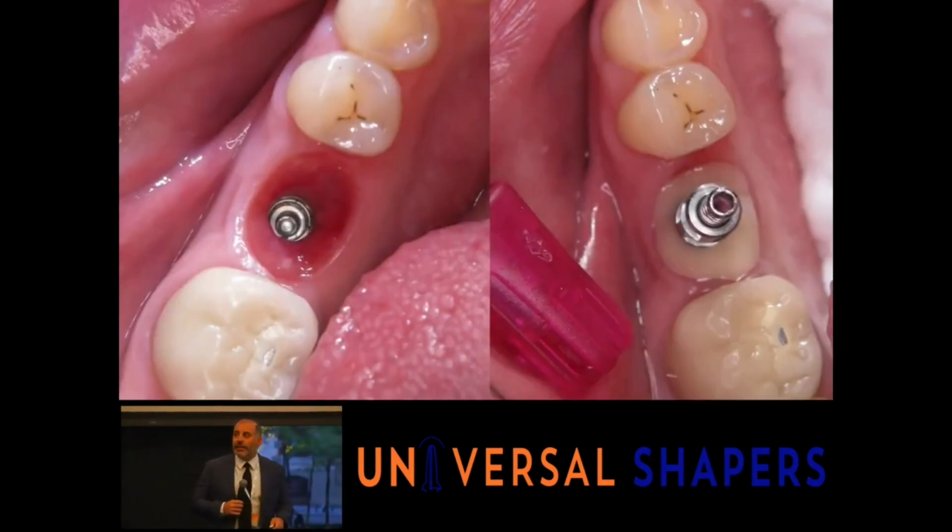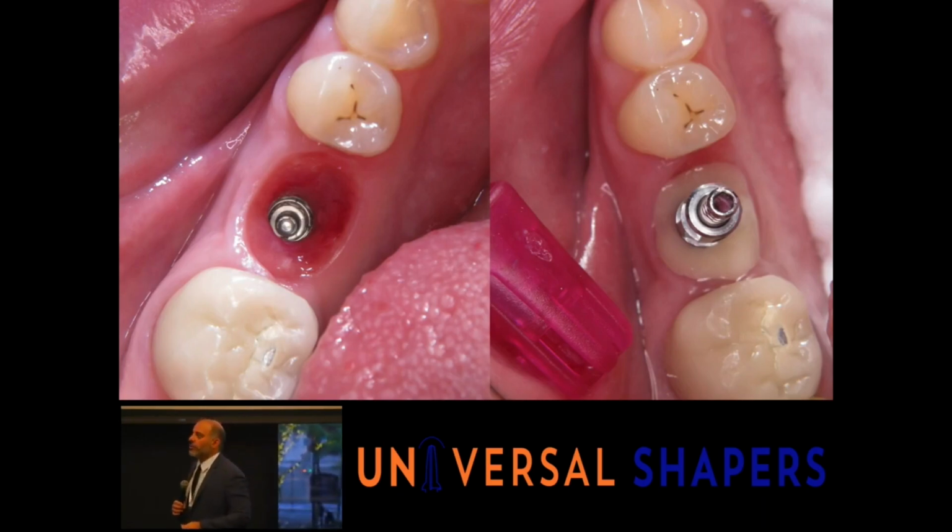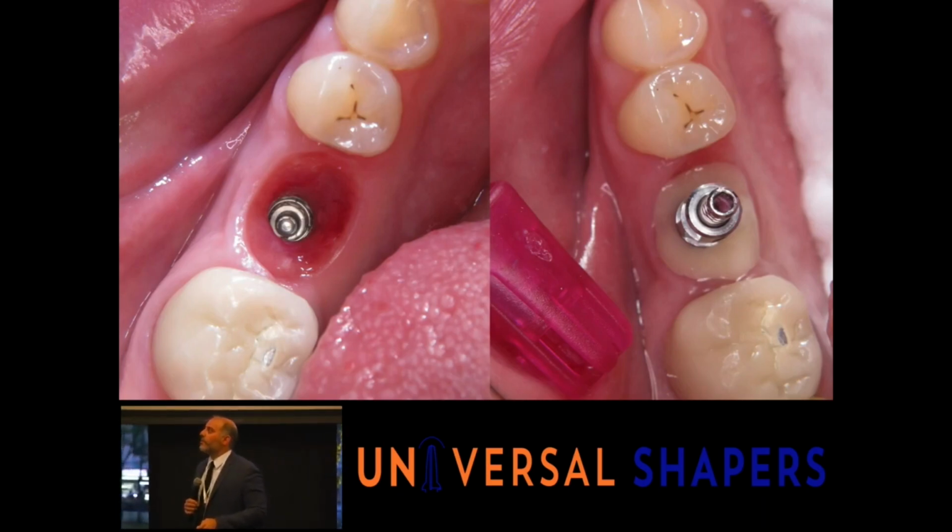One little piece of advice: I'm scanning in my office. I use intraoral scanners. I have several of them, and beta test a bunch of these products as well. But if you are using analog impressions, this is what the transfer looks like. It's quite skinny here. It's pretty skinny. So when we have a big sulcus like this, we really want to try to capture all of that sulcus.